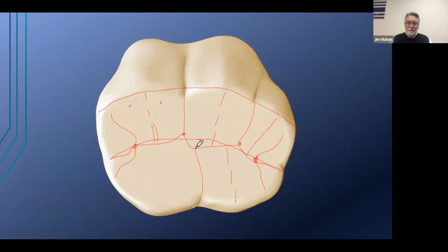On this lingual cusp, I'm also going to use this, and that's not exactly the same place that one is. It's more like right here. And so I'll go this way. And notice, just because we use these guidelines, all of these cusp ridges are oblique. They're at an angle to the central groove.